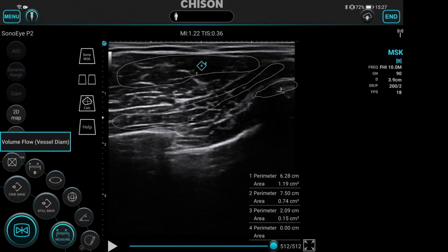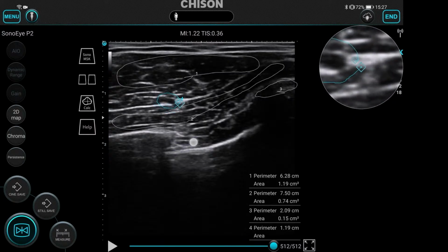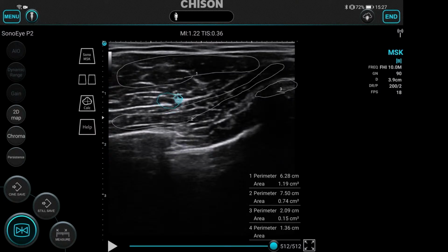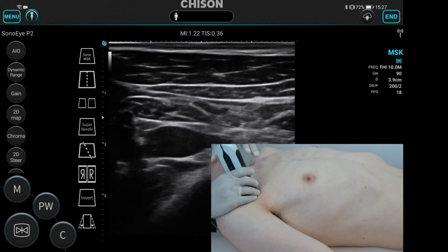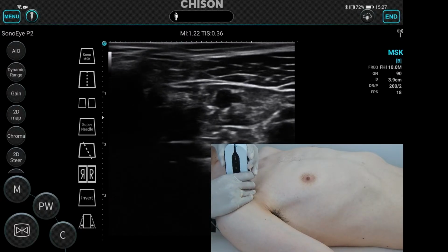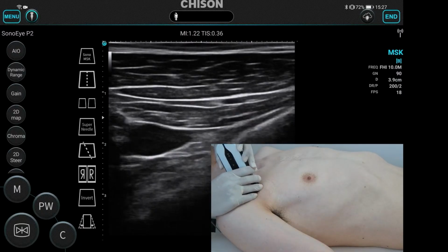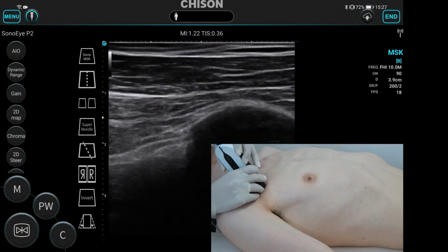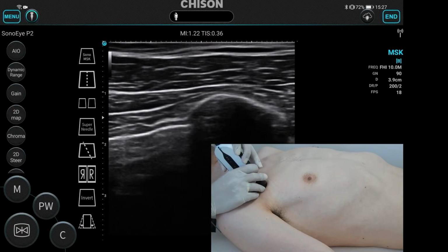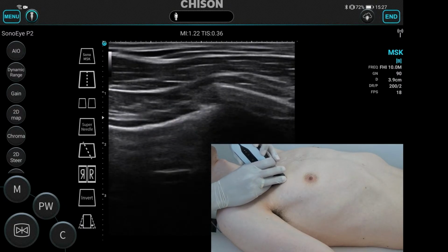Do not forget to be cautious of the thoracoacromial artery, over here. So now we will scan again and I will show you the thoracoacromial artery, which you should always try to avoid. Okay, so start from the clavicle. We can see the clavicle again, and the axillary artery. Just below the clavicle, below the axillary artery, we will have the first, the second rib, pectoralis major, minor. We have the second rib, and we have a third rib.